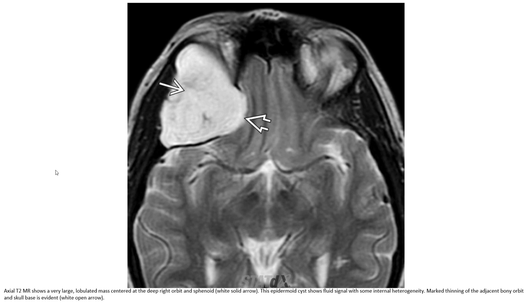This is the axial T2 of a very large lobulated mass centered at the deep right orbit and sphenoid, while the solid arrow indicates this epidermoid cyst, so fluid signal with some internal heterogeneity, mass effect thinning the adjacent bone, orbital and skull base is evident, wide open arrow indicates.